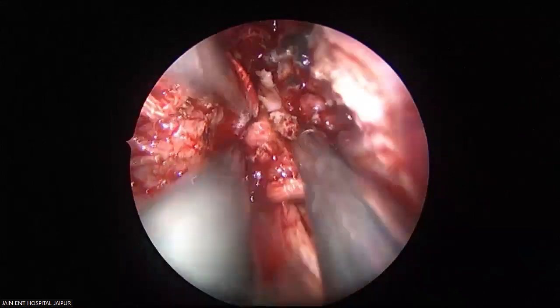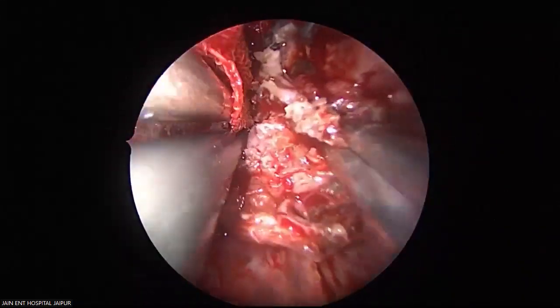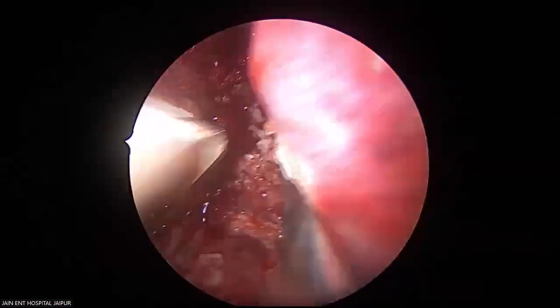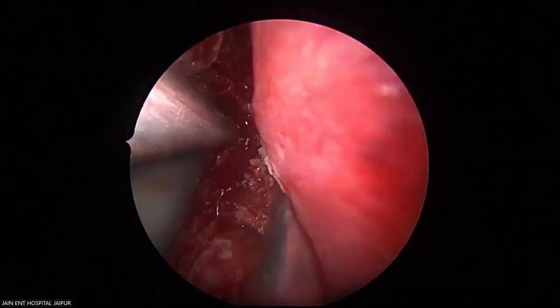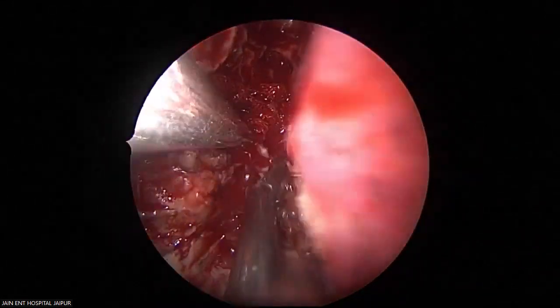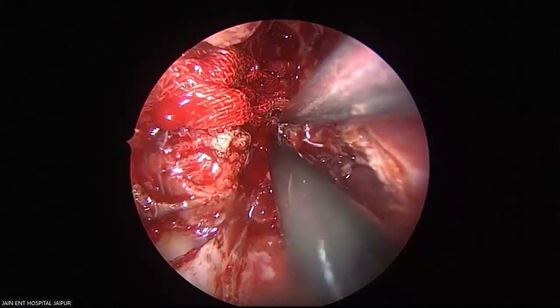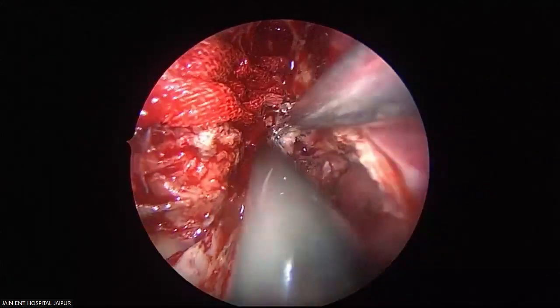See, with full irrigation. See the posterior wall? Expecting a little bit of the oozing. See, I am just bang on the bone.